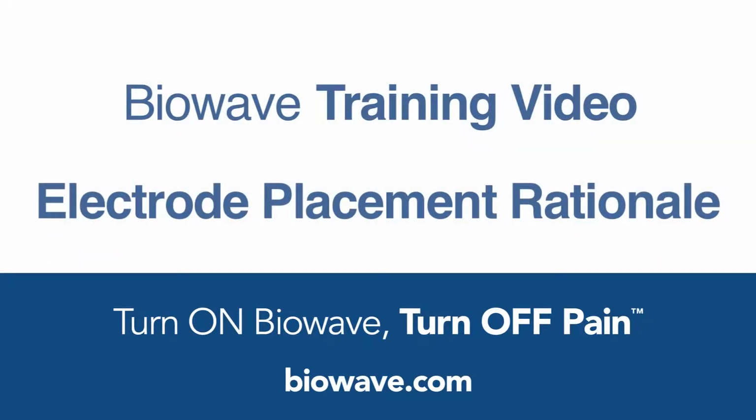Biowave is a very simple to use system, but the way that the electrodes are placed is completely different than how you've been taught with conventional TENS or interferential or other types of electrical stimulation. So it's very important to understand the rationale for our electrode placement. So I'm going to start by explaining our signal technology, and that will provide the rationale.